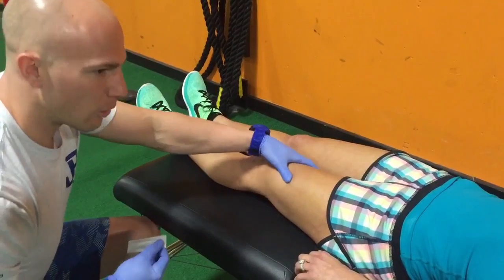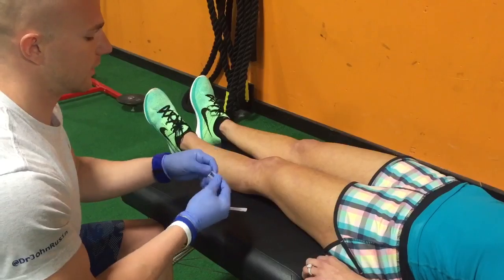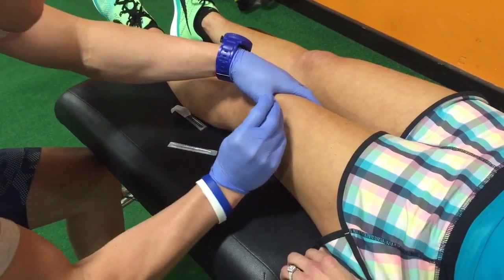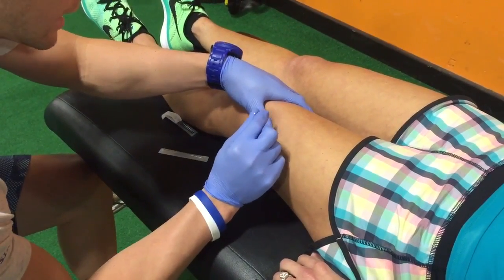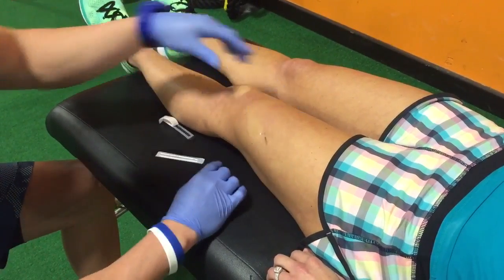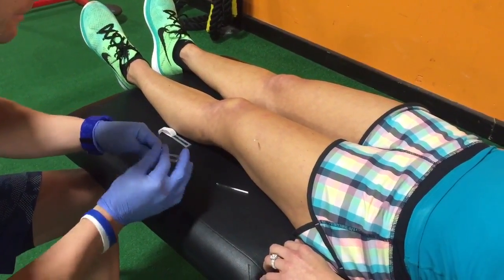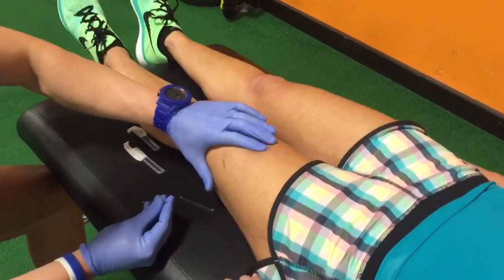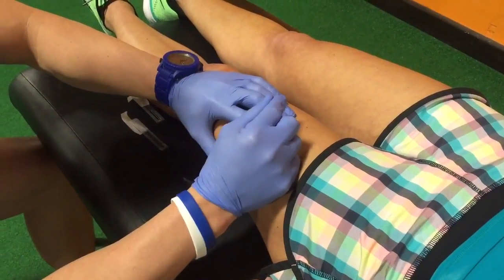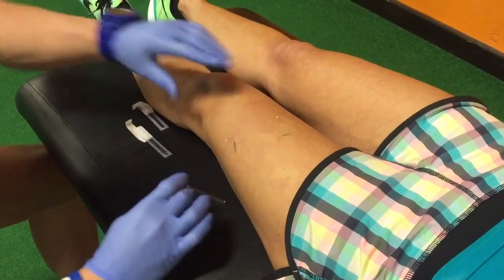I'm going to be palpating a point — it's pretty tender there — and then taking out the dry needle, palpating that same point, and inserting. We're going to drop this deep, get it into that trigger point, and drop deep to the bone. That's the vastus lateralis, the most lateral quadricep muscle. The second muscle we're going to get is the rectus femoris that we just mentioned — it runs down the midline. We're going to get another tender point, needle in, and drop right down onto the femur.